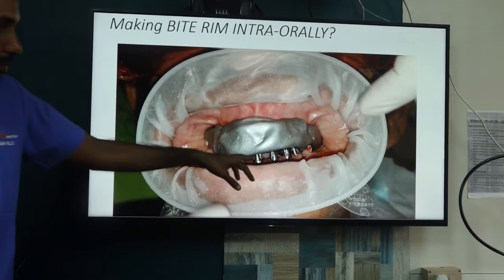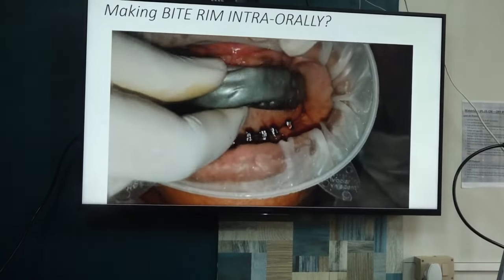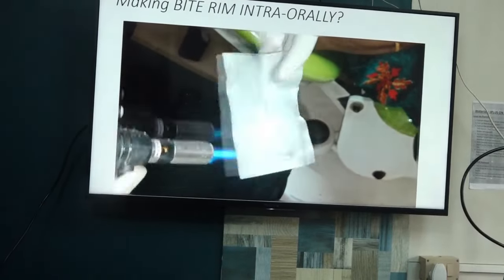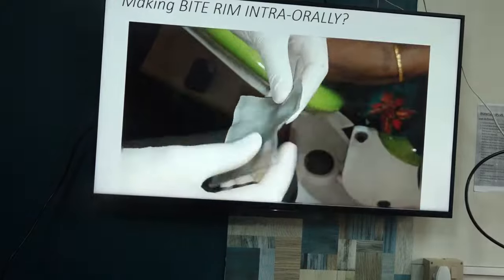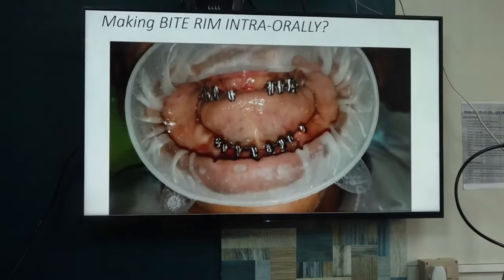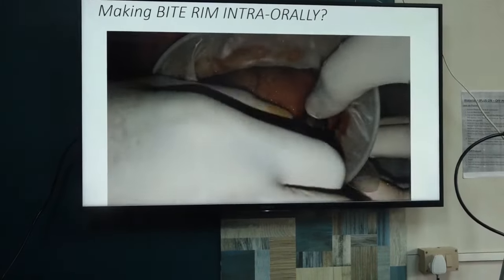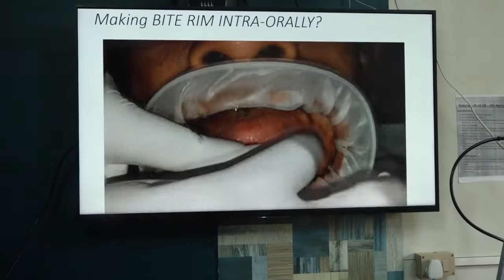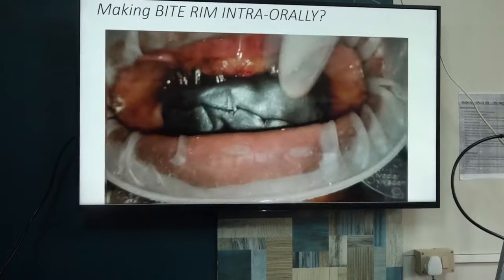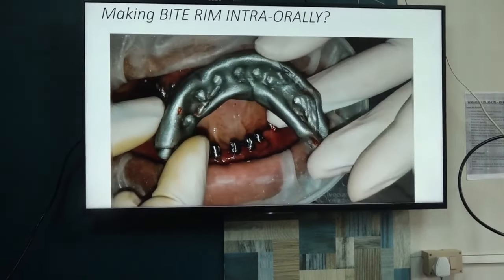Then you ask the patient to bite, the lower implants will go into it. So this is how uniformly you do it. Take a proper size. See how the finger is pressed buccolingually, right? Now we have to improvise the bite rim further.